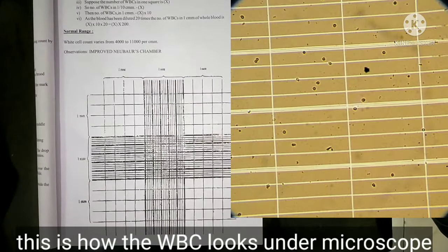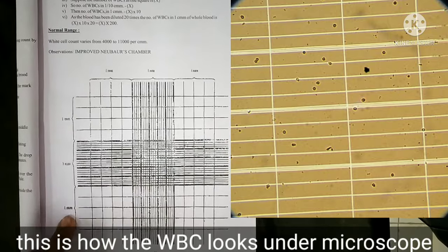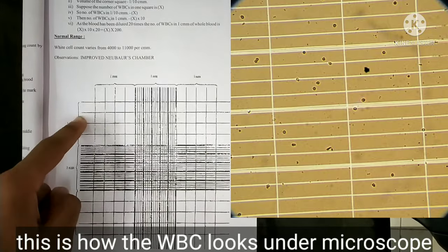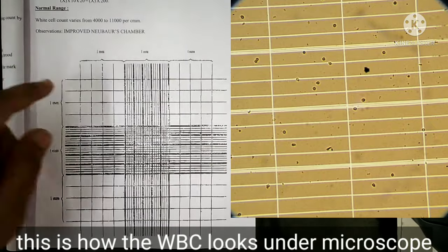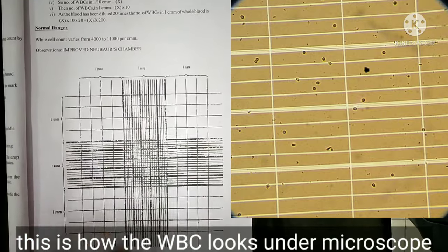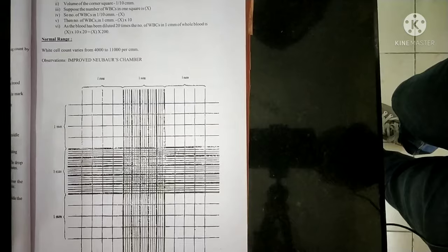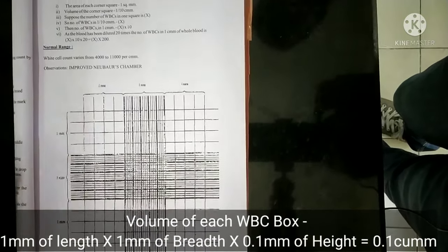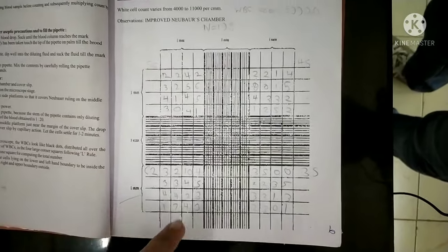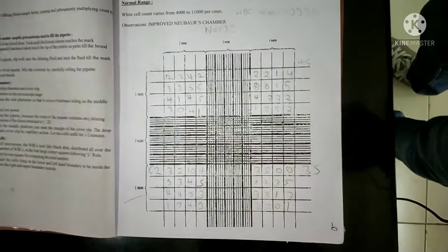This is the diagram for the Neubauer chamber. Here, here, here, and here we count the white blood cells. Start from one corner, and however many white blood cells you see in the microscope, record the count, then complete the whole chamber. The dimensions of the Neubauer chamber are 1 mm length, 1 mm breadth, and 0.1 mm height, so the total volume comes to 0.1 mm³. This is the completed Neubauer chamber diagram, with each square having some number of white blood cells as seen in the microscope.